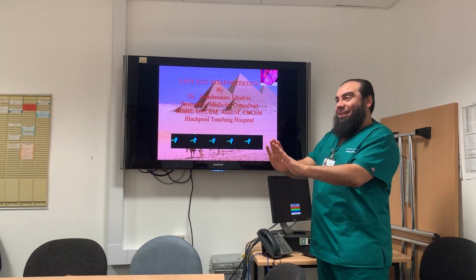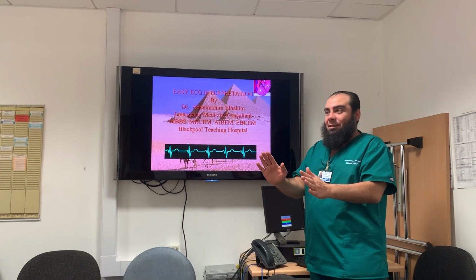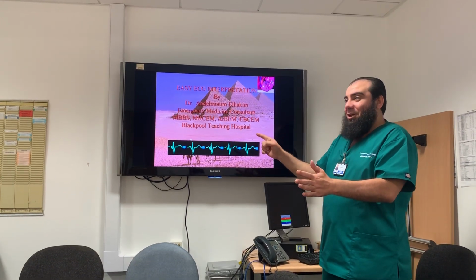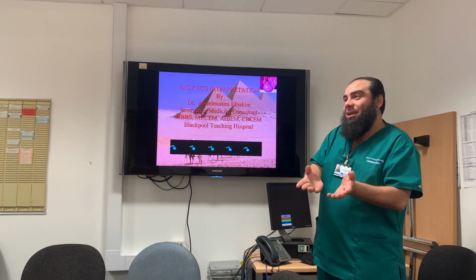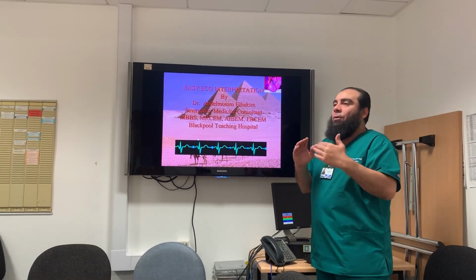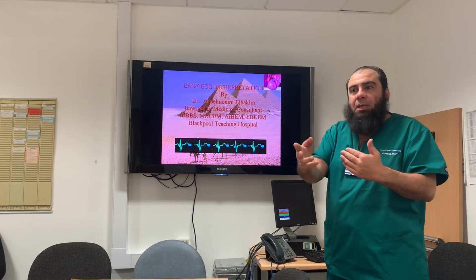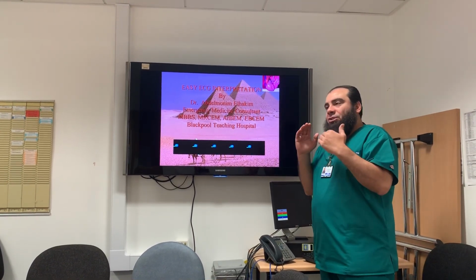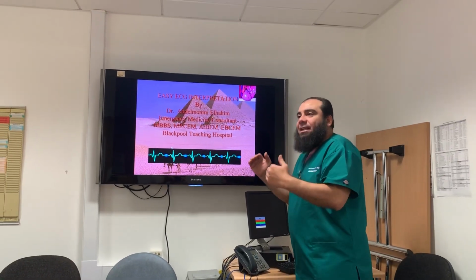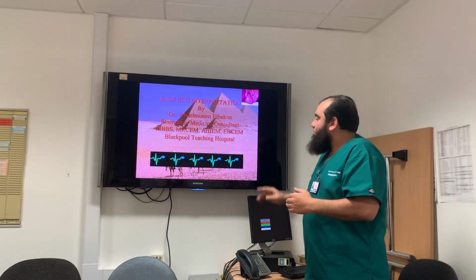Do you know about PEA? Has anyone been certified for ALS? PEA is pulseless electrical activity. Electrical activity is there, but there's no pulse, no heart function even. So it is only electrical. We're going to discuss depolarization later on. But just to put in your mind, ECG is just a recording of the electrical activity of the heart. Is that all right? Okay.